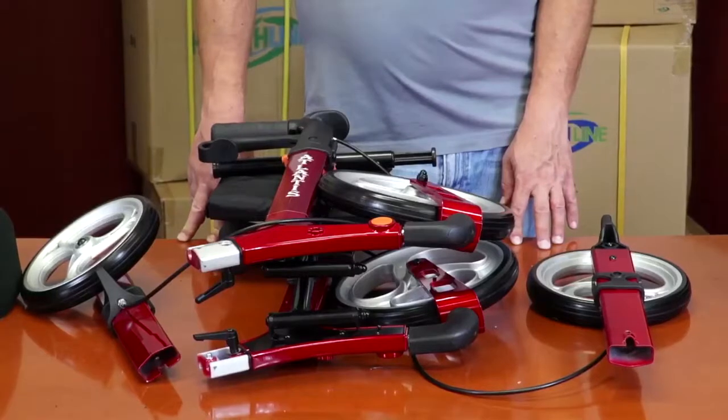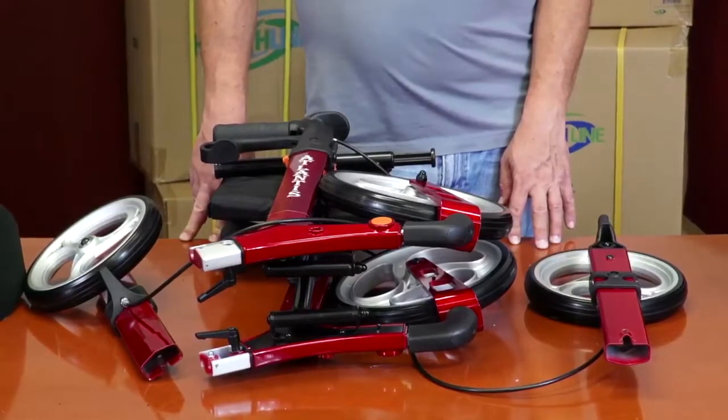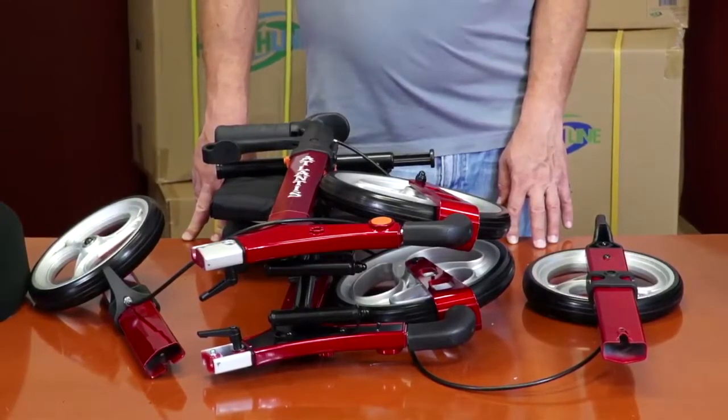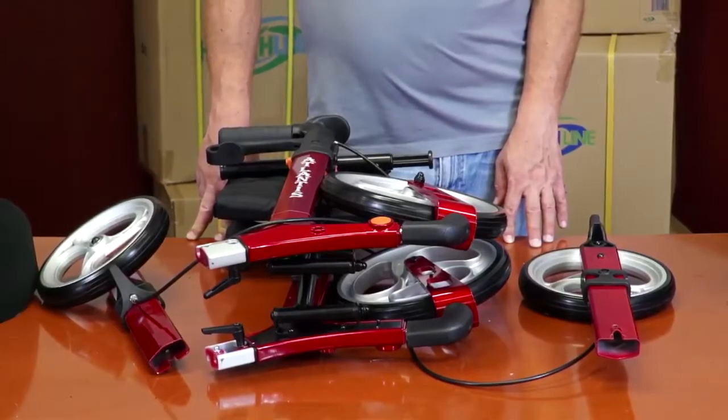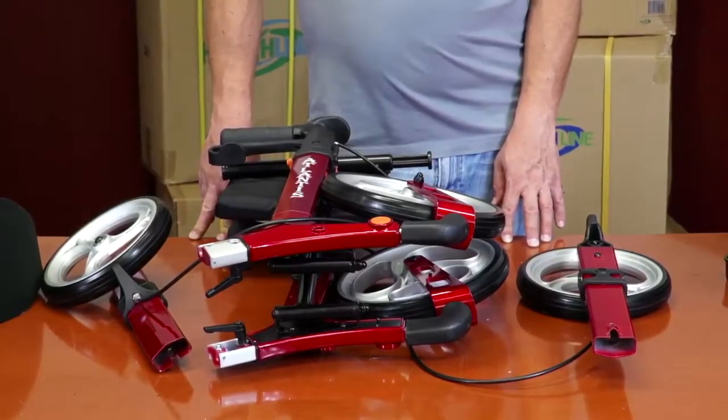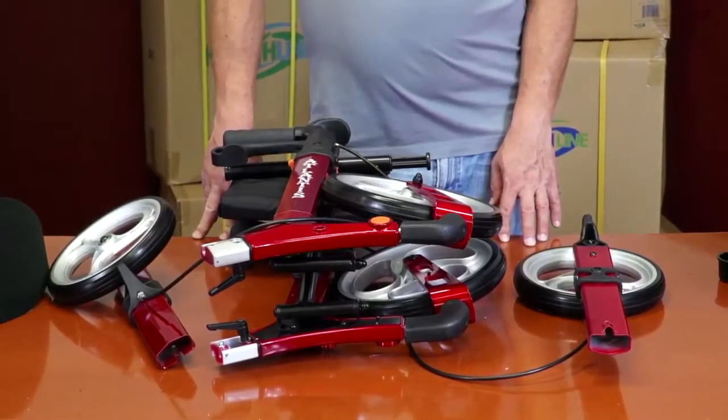The six parts are: the main rollator frame assembly with larger front wheels and handles pre-installed; a pair of rear detachable legs with smaller wheel brakes pre-installed; a removable back support; a removable storage bag; and a cane holder cup.